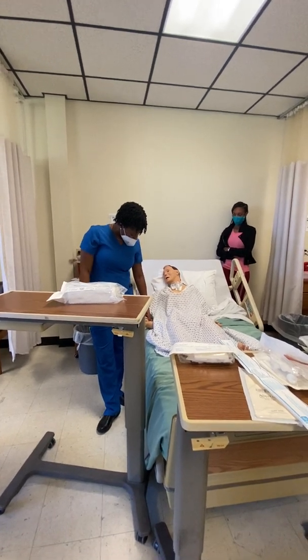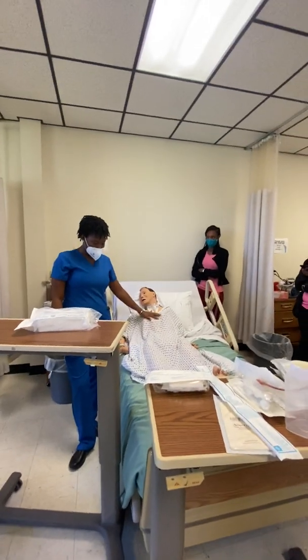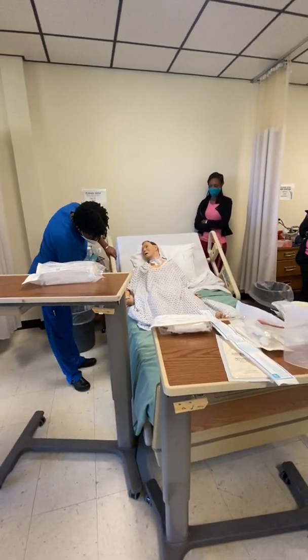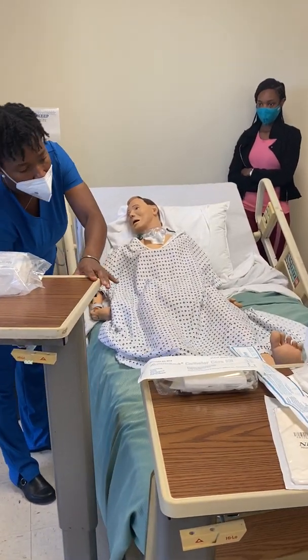This is Miss Jones, and date of birth is 1/13/96. He told me all of it. He's just talking to me. He says he has no allergies, okay? So we're gonna let the bed up to the waist, a good working height.